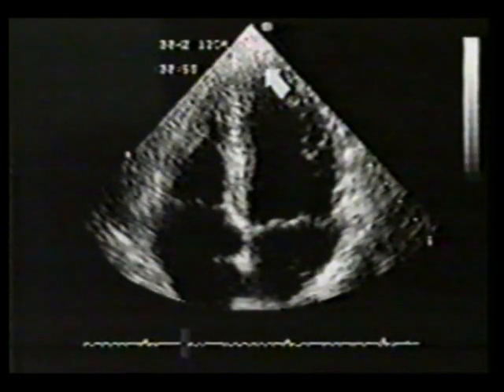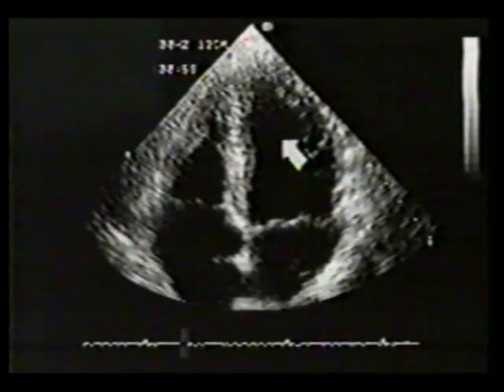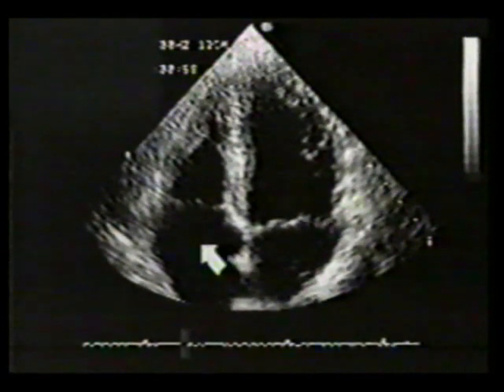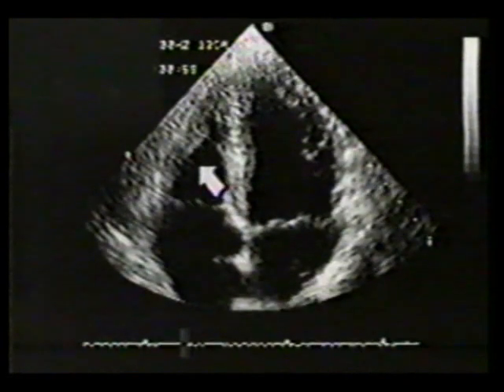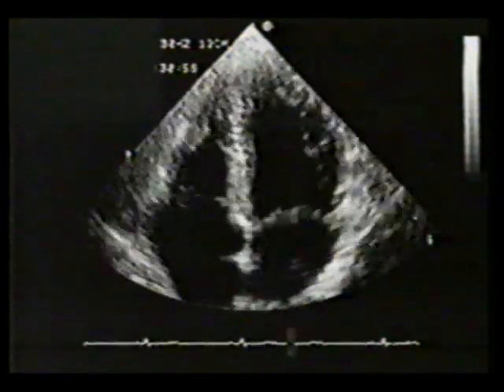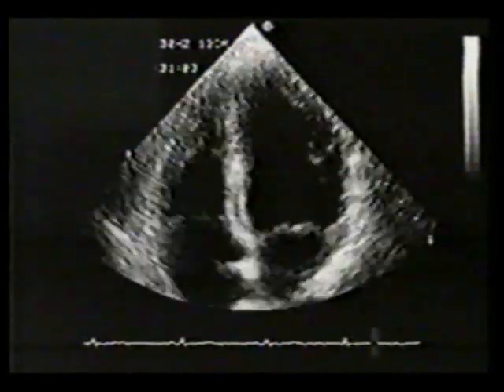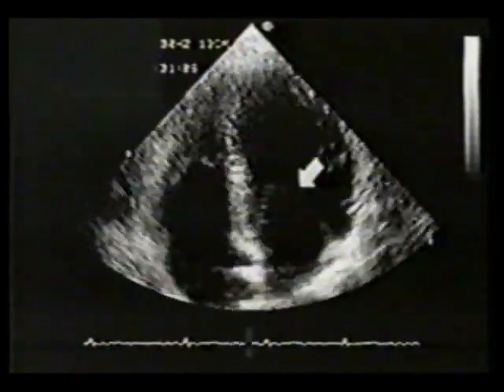Many institutions display this view with the left ventricle and left atrium to the right of the screen, and the right atrium and right ventricle to the left of the screen. In real time, note the normal motion pattern of the tricuspid and mitral valves.